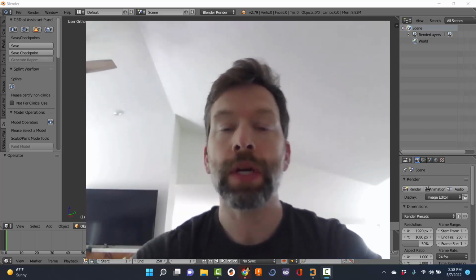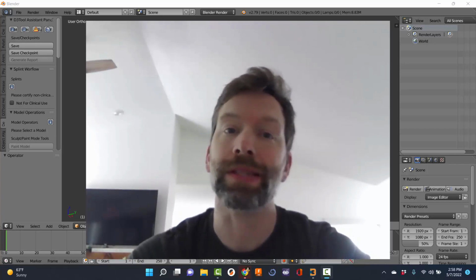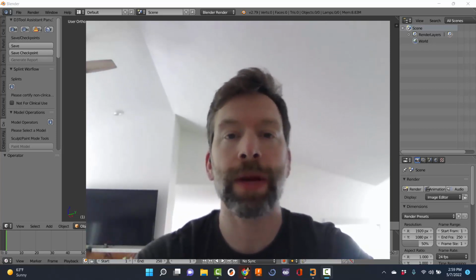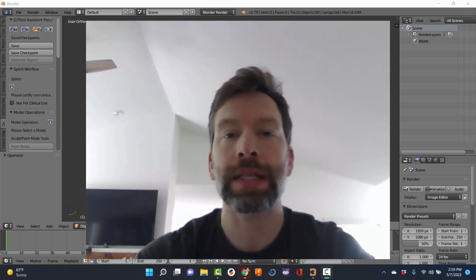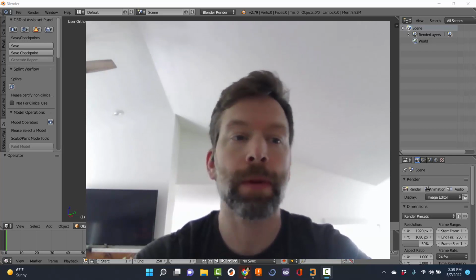So I want to make a video. This is aimed for anyone that's interested in the software, but this is hopefully actually going to be aimed for my own assistants to learn from. And so I hope that it's something that you can also use to teach your assistants and have them use. Again, this series of videos I've made, I started over a year ago and I'm adding on today, is really intended to be a video you can play right as you are designing, okay? So that you can basically replicate what I'm doing on your own screen for your first couple times until the point where you no longer need me, and maybe it's one time.